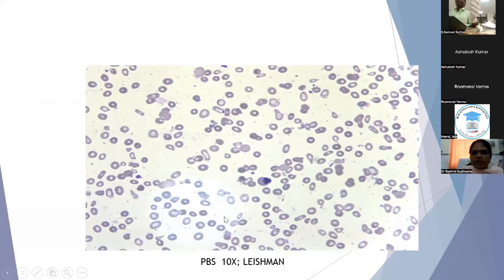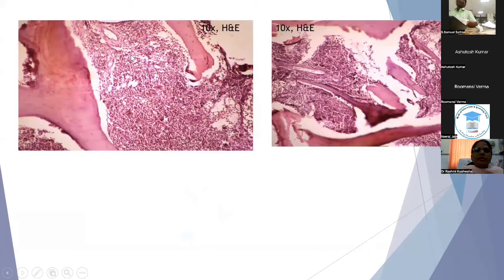Characteristically, we can see all the WBCs are reduced, and the platelets are reduced. We see the presence of nucleated RBCs here. So this is an indication that something is happening in the marrow that has pushed these cells into the peripheral smear, causing the presence of teardrop cells, a lot of anisocytosis, and occasional target cells. And this is a trephine section that we obtained.